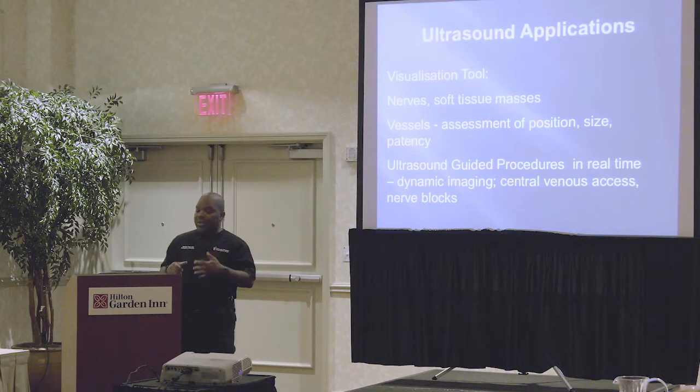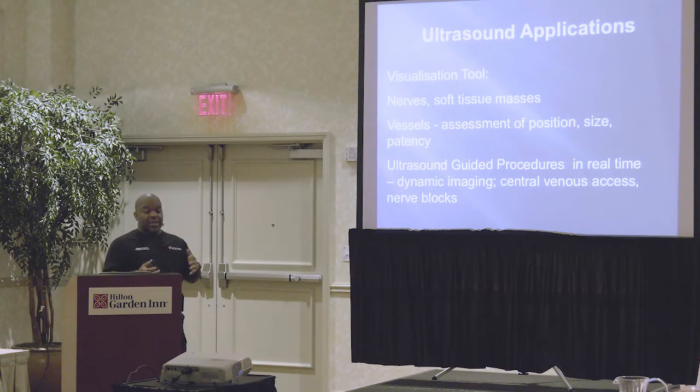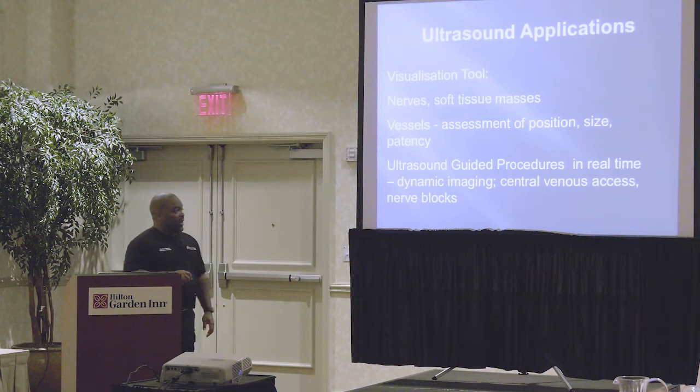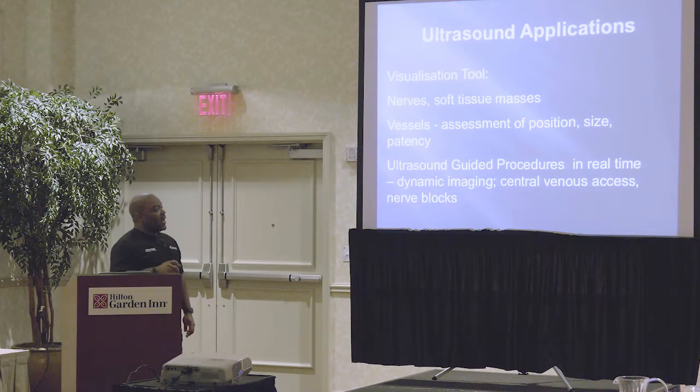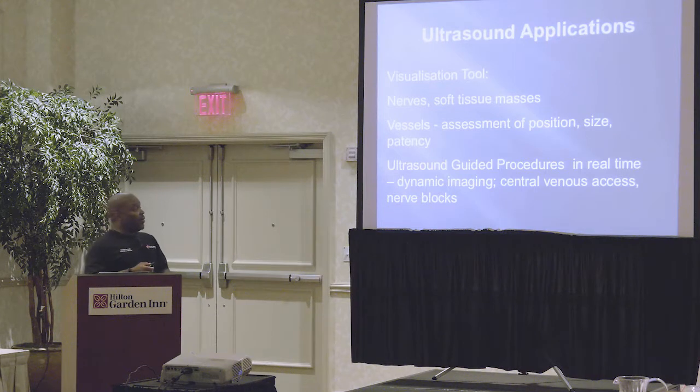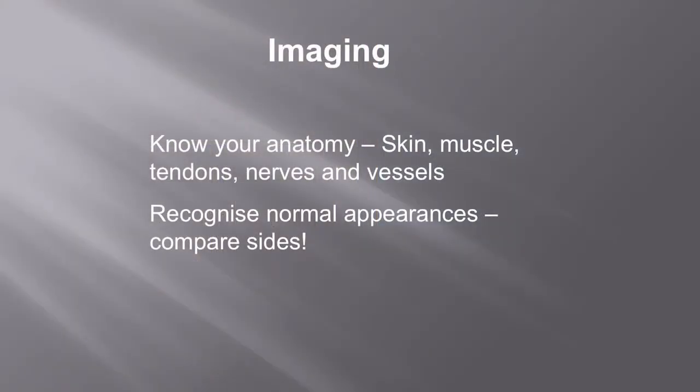No, a lawyer can't go and say, oh, well, you know, my client was very good at doing blind sticks and so they did a blind stick and oops, we messed up. No, it's ultrasound guided requirements. So you must do that, all right? We're getting to the point where abscesses are gonna be ultrasound guided. But it's not required yet, okay? But the more you can use it, the less complications one's gonna have. So if I do a central line and I decided not to use my ultrasound and I drop their lungs, for example, then that's gonna be it, okay? Then I'm gonna lose my license, go to jail, and become someone's prison bitch. So just make sure that you guys are using the machine for ultrasound guided requirements, okay? All right, so here are some of the images that we're gonna work through, all right?